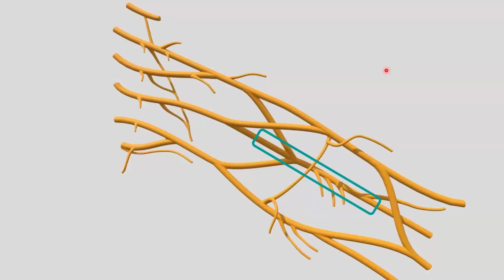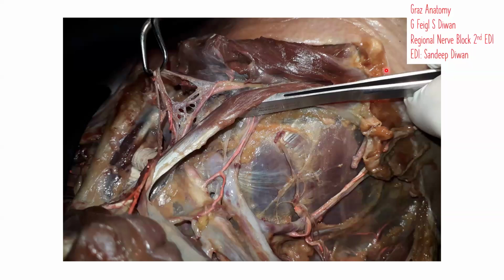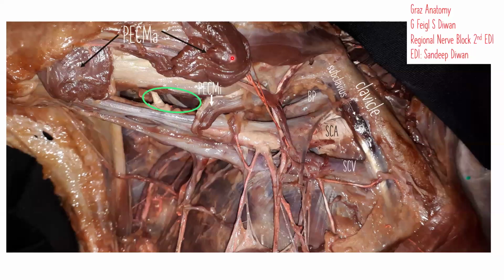Yes, sir. So we are going for the traditional or conventional parasagittal infraclavicular block, where the probe is positioned medial to the coracoid process, in the parasagittal approach. When we start dissecting, we need to remove the pectoralis minor, and when we remove it, you can see we come from cranial to caudal. This is the cranial, that's the caudal, that's the lateral, this is the medial.